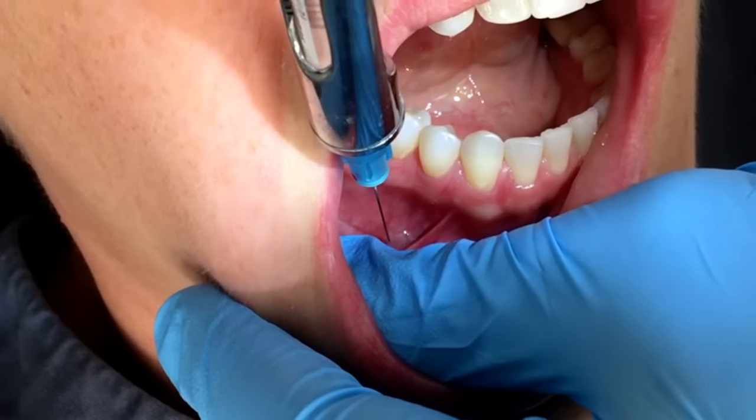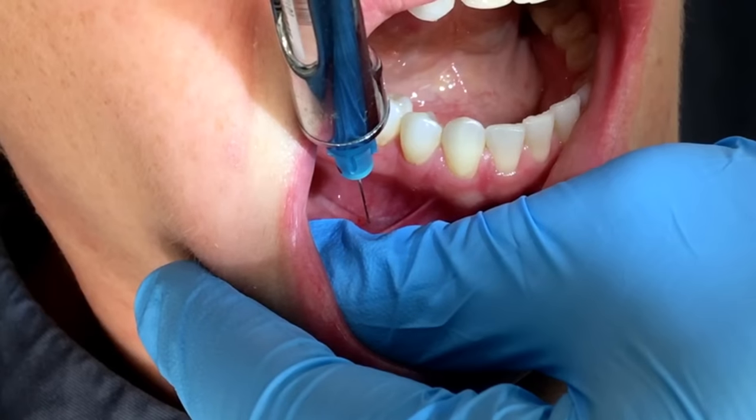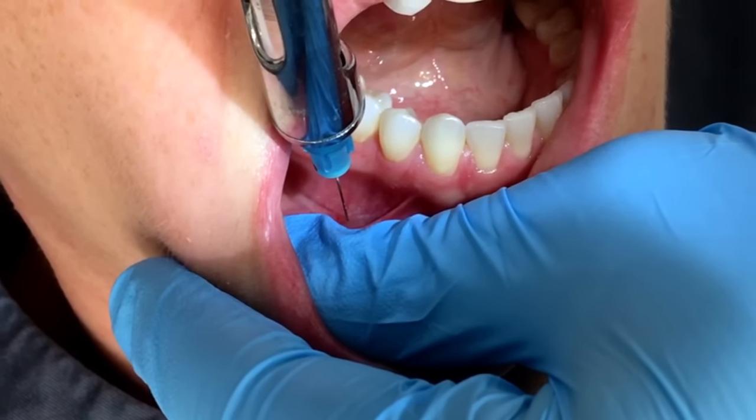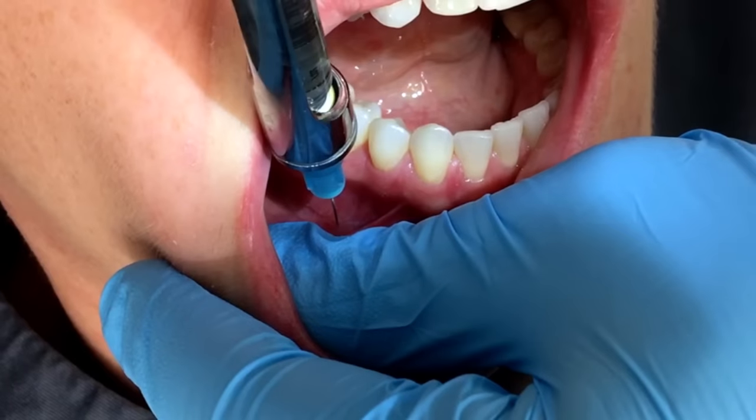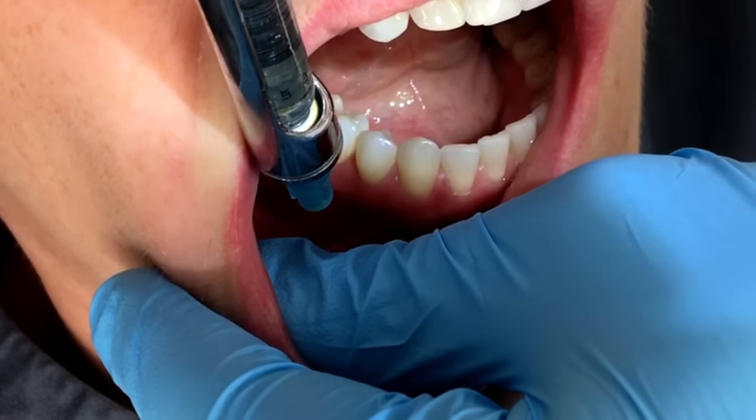When you enter right in between those two premolars, I've got minimum — I'm going to go to maximum — and then I'm going to deposit about a quarter to a half of the cartridge.